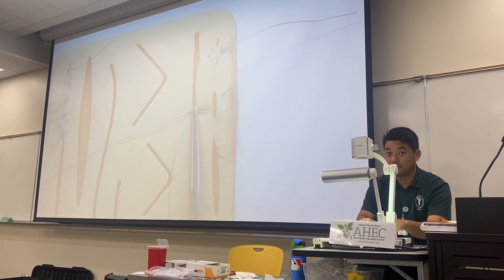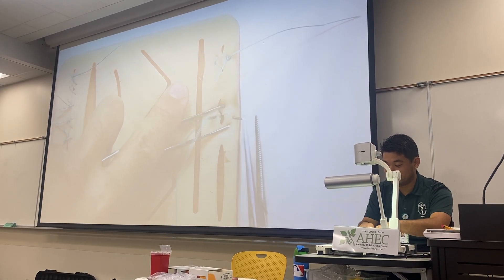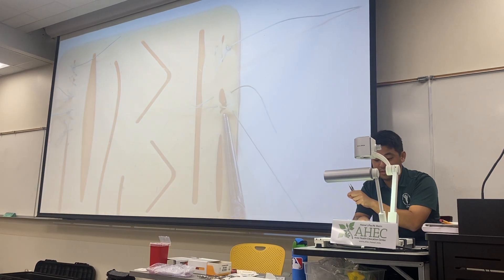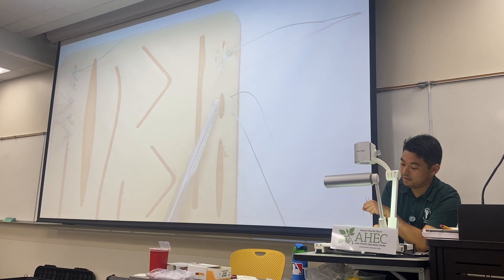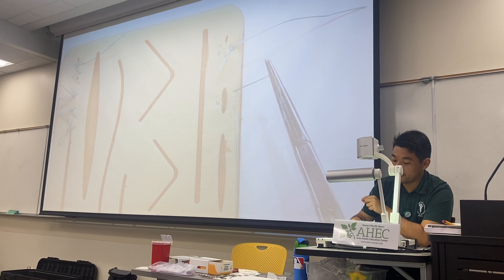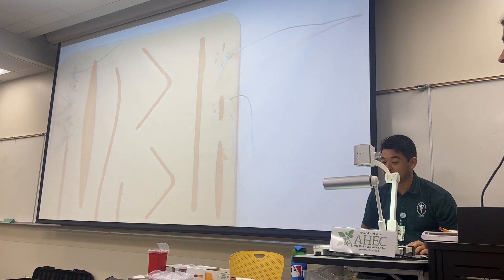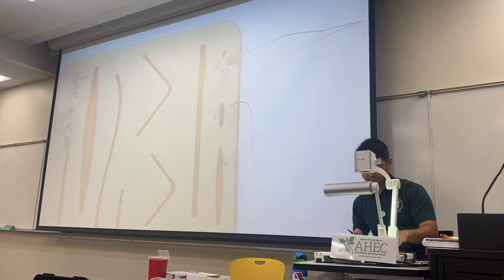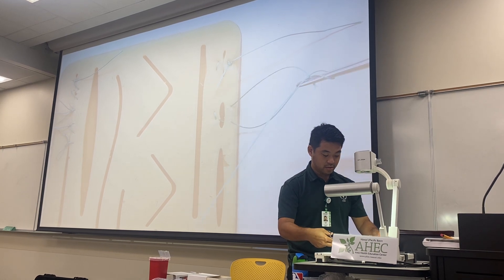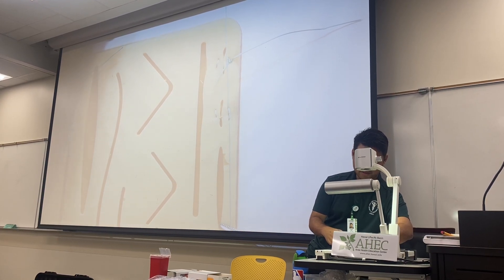Back through the other way — it's real awkward the first time you do it and then it feels fine. Okay, almost there. We're left with a little bit of thread on this side, and we're gonna put our knot right here. As it closes up you can see how much surface area the load is being shared on. Let me get in a good position so you guys can see. Money shot — see how evenly it kind of closes up?